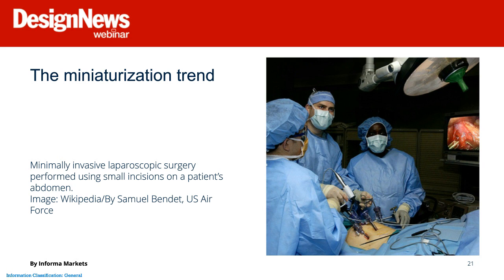So the miniaturization trend moves on here. We have laparoscopic surgery. Laparoscopic surgery is another example of how it's changed medicine. Instead of surgeons making a major incision that would call for weeks of recovery, laparoscopic surgery enables them to do major interventions with only a small cut or cuts to the abdomen. The key invention is the laparoscope, which is a long fiber optic cable that allows viewing of the affected area by snaking the cable from a remote location.